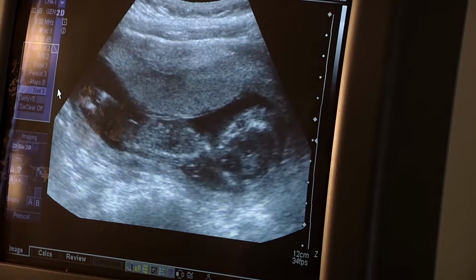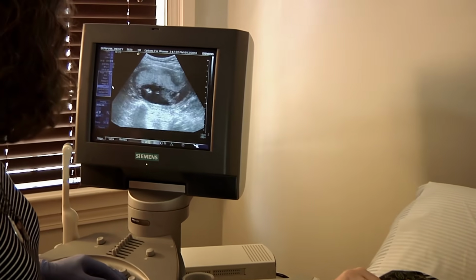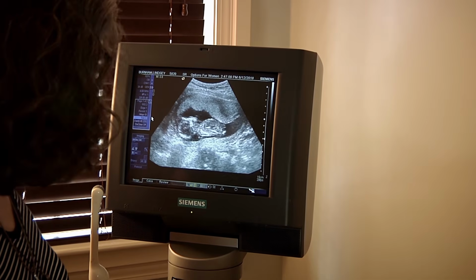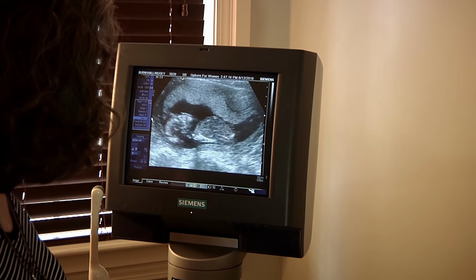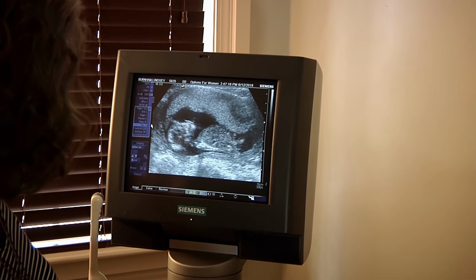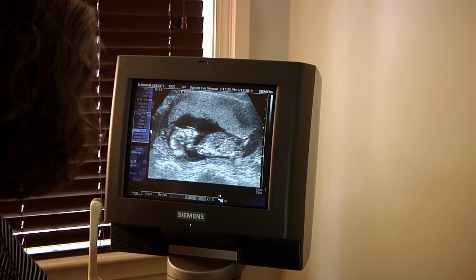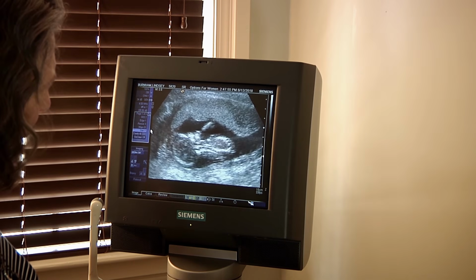Does Lisa want to? Okay, baby's laying on his back. Yeah, wasn't the head over this? Yeah, he's done some moving around. That's a cute picture. That's cute. That's a cute one. Freeze that. It's weird. It almost looks like he's got a pacifier in his mouth. Looks like he's got the hiccups. Yeah, that's what I was thinking. He was jumping.